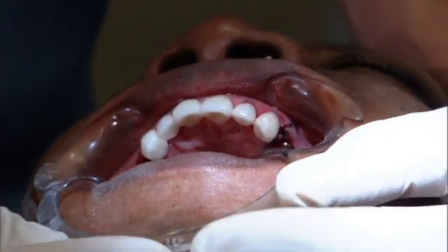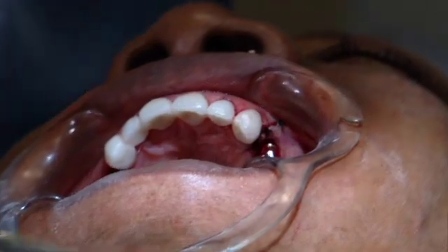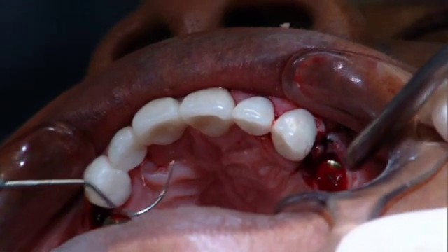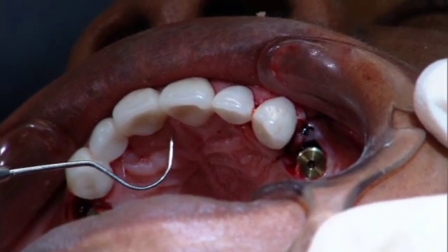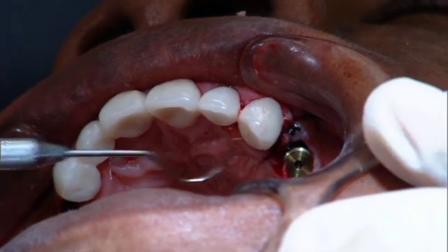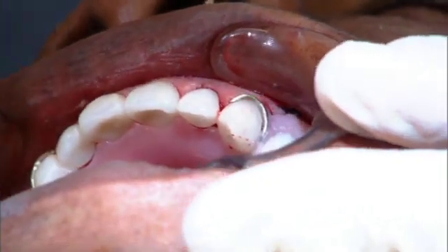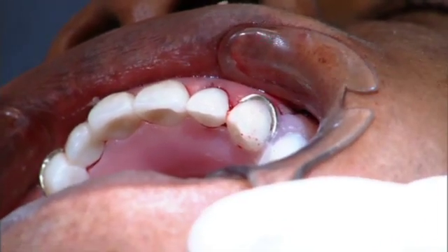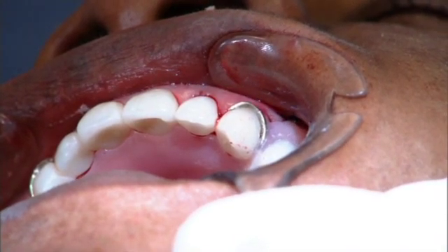What I've done now is I've turned Beverly upside down on her head. The reason I did that is I want you to be able to see the lingual contours of the provisional. Right back where Kathy just brushed that suction, that contour back there is going to also provide us support on the interdental papilla out on the labial. Plus, my temporary partial fits right to it, so that I'm not going to get any movement of the temporary partial or the teeth while she's healing. And that's critically important.